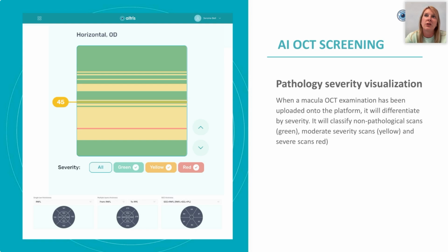In Heidelberg, it can be more than 13, more than 20. In most devices, there are 64, 128. In some cases, there are 512, depending on the OCT device and the version of the device. So basically, DICOM contains information about the device, the screening protocol, the scanning protocol, and all the images.